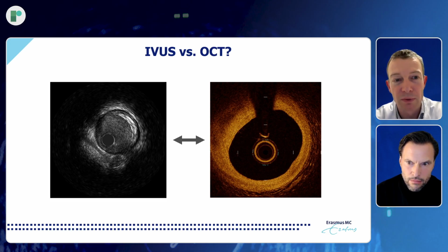But conversely, in routine practice, in my opinion, there are two things of critical importance when looking at the intravascular image. One is the ability to see landing zones and plaque characteristics. With that, I think both technologies are suitable, with the difference that with IVUS the penetration depth is deeper, so you typically see the whole vessel. In this OCT image on the right, you see a nice three-layered appearance somewhere between 3 o'clock and 7 o'clock. But between 7 o'clock and 2 o'clock, you no longer see the media, which means you need to visually interpret where you think the media should be.